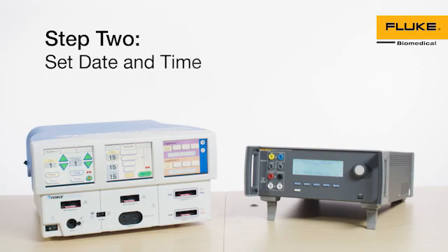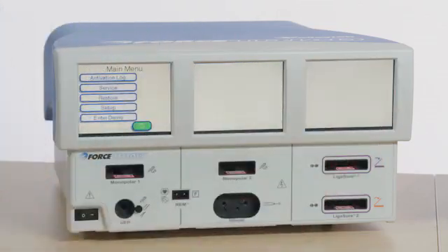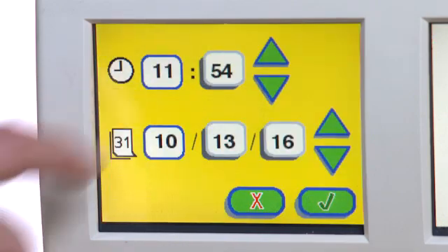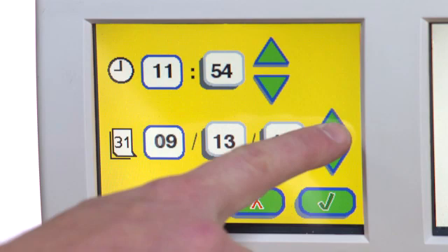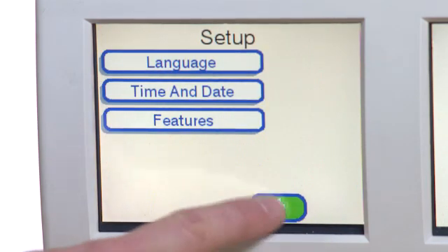Reboot the system to save the calibration data. Step 2: Set Date and Time. Touch the Wrench icon. Select Setup. Select Time and Date. Adjust Time and Date, and then press Enter. Select the Back button to return to the main menu.